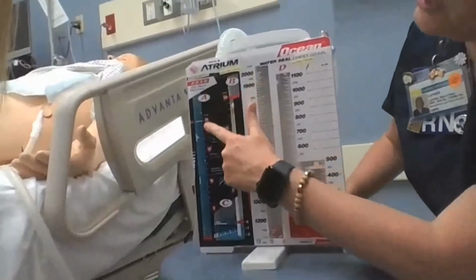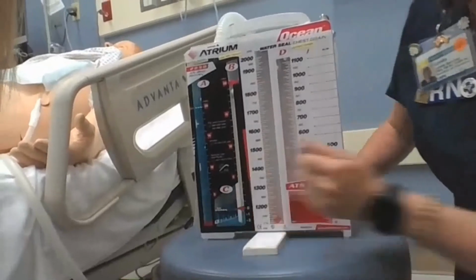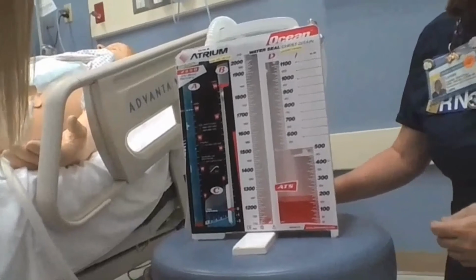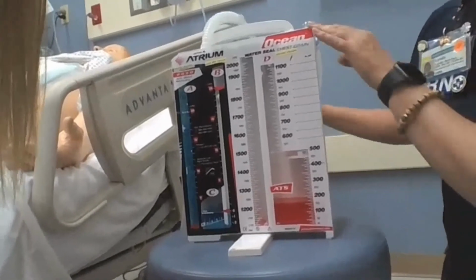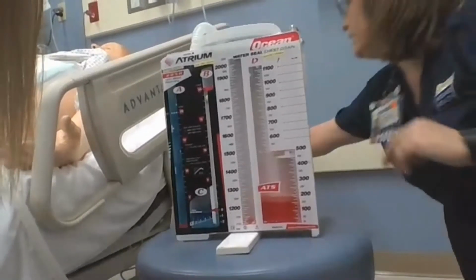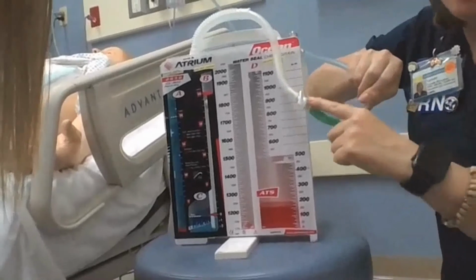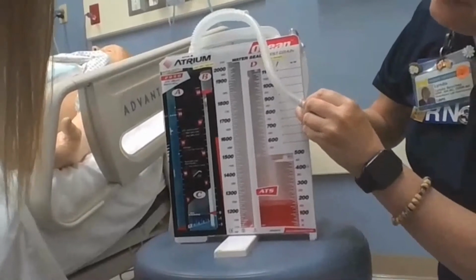So this first chamber here is your suction control chamber. The suction control chamber is dictated by how much the doctor has ordered. They'll order 20 centimeters, they'll order 15, but typically it's 20. You have this dial right here at the very back, the dial that we use when filling up the chest tube, that can adjust how much bubbling is in there.